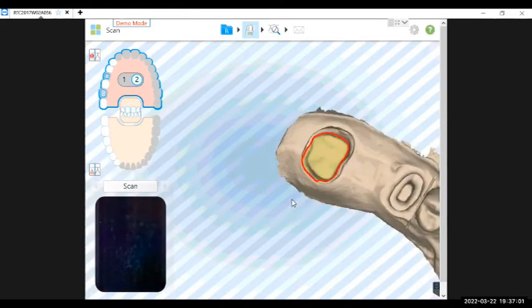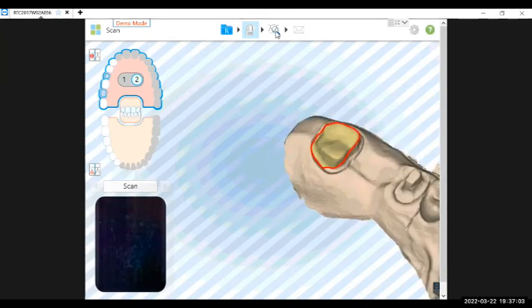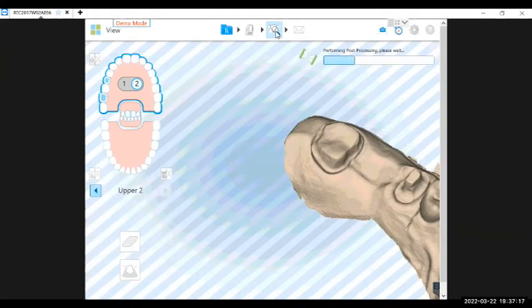Still, I want to make sure it's a good scan for you all. So I'm going to go back to post-processing. The reason why you want to take it from the buccal or the lingual, that lateral view that Brittany mentioned, is so that if indeed your preparation itself was beautiful, you don't want to inadvertently erase any of your beautiful margin and have to rescan it after perhaps there's been some tissue collapse. Thank you for clarifying that, for sure. Of course. Definitely important.